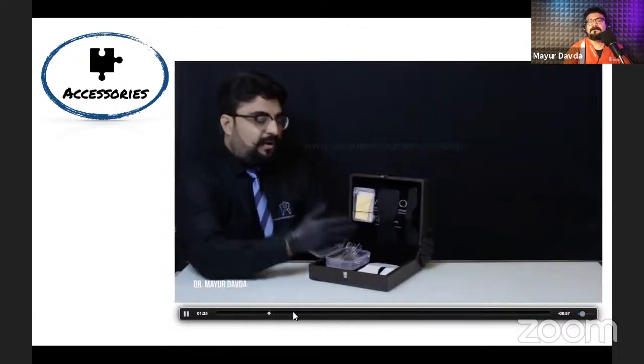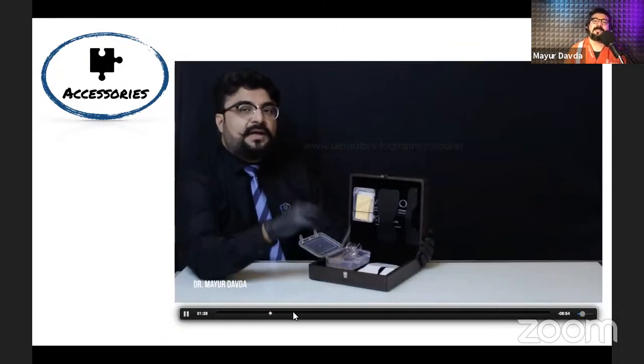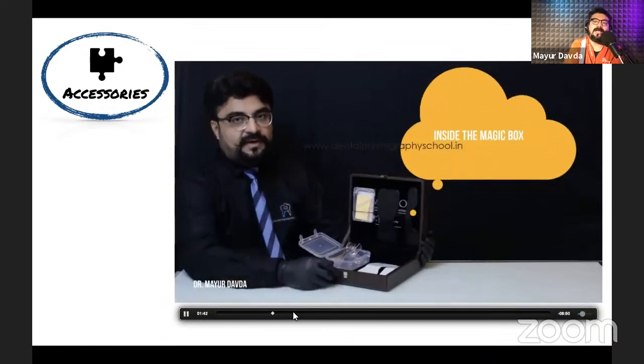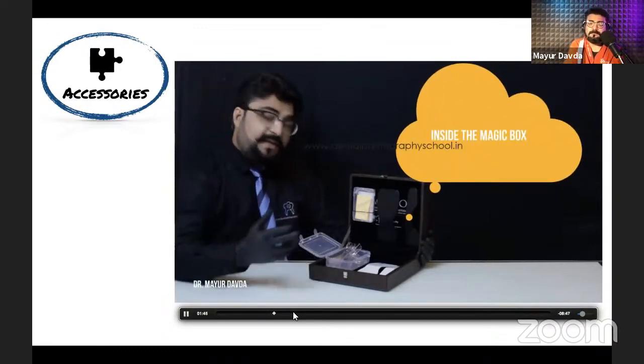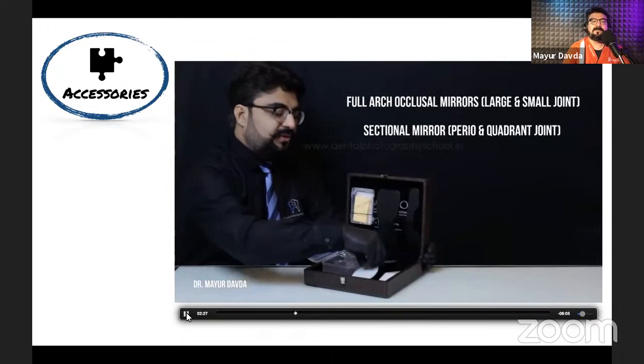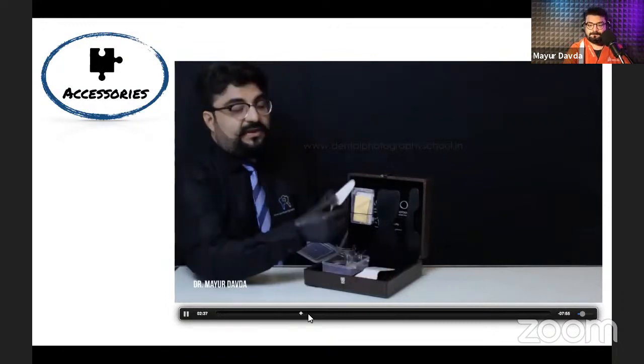So basically, you need to have different shapes of cheek retractors and different sizes of contrasters as well as mirrors. Okay. So different accessories are useful for different purposes. What I'm explaining in this video is you need to have intraoral accessories like mirrors and contrasters. They should be contra-angled, and they should be front surface coated mirrors. They should be rigid, and they should be available in different sizes.